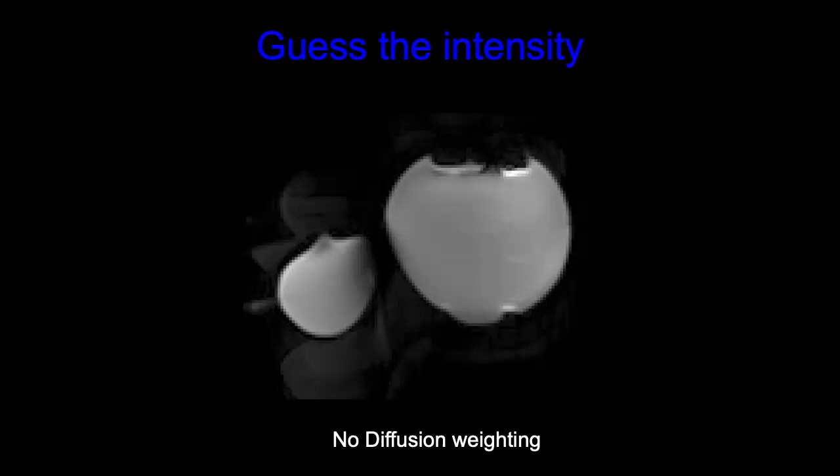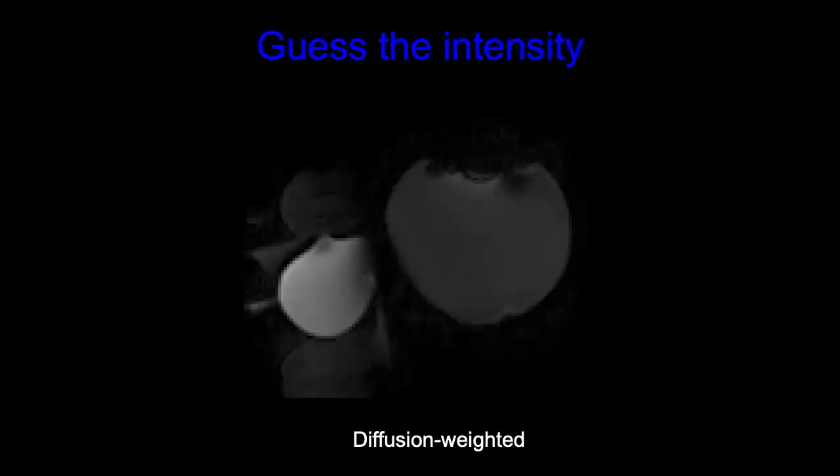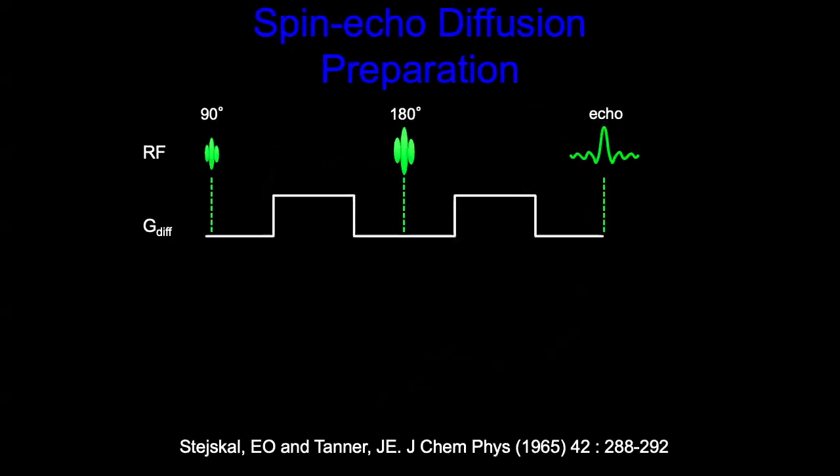In which of these do you think the molecules will move more, the viscous polymer or the free water? The free water, exactly. So what's going to happen to the signal? Will it be less in the big one or more in the big one? It is less, because the water moved more, so the signal dropped more because of that diffusion. Okay, so now you've got a visual concept of it.